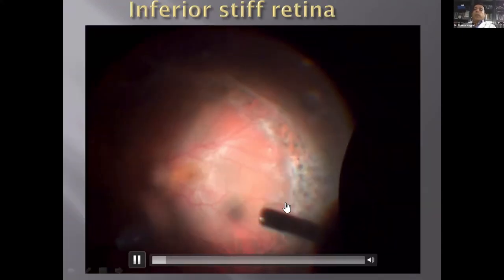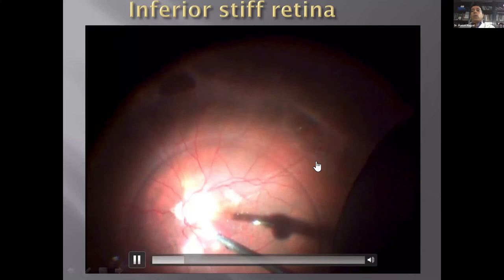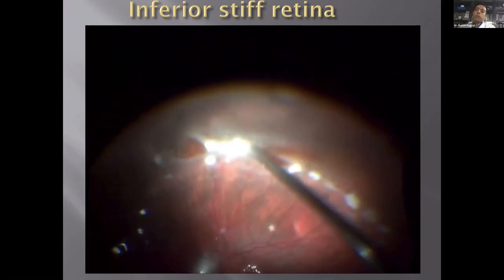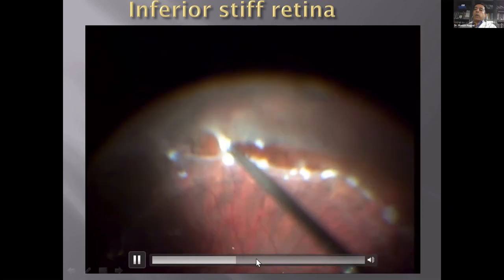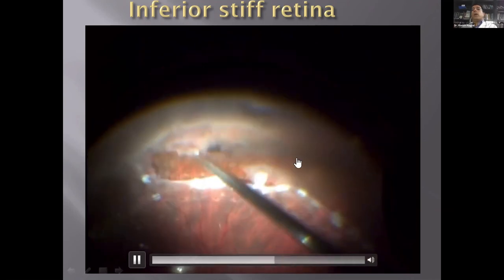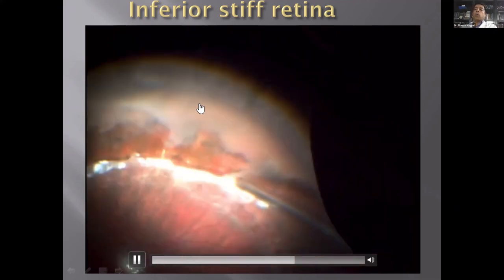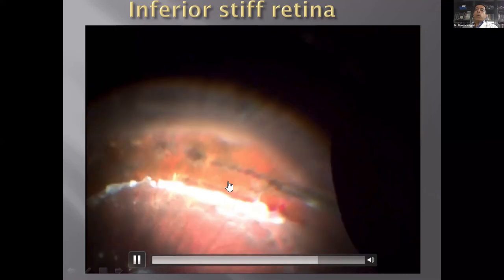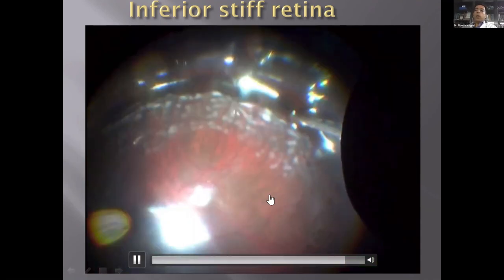This shows an inferior retinectomy — oil has been removed, there is inferior detachment with PVR. Put PFCL, do diathermy to all large vessels, with PFCL bordering the inferior retinectomy site as a safety boundary while cutting the retina beyond the diathermy mark. Remove as much of the peripheral retina as possible, since it is redundant tissue that becomes a scaffold for future proliferation — new vessels can form on it and create further problems. Small oozes occur; raise pressure to stop them. The advantage is PFCL will not let blood trickle to the central part.